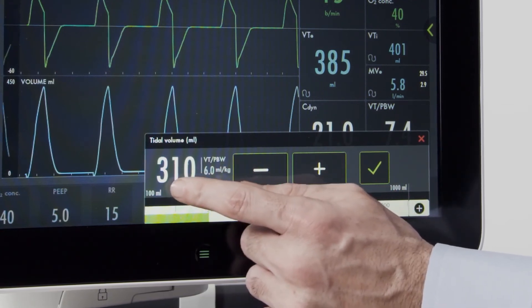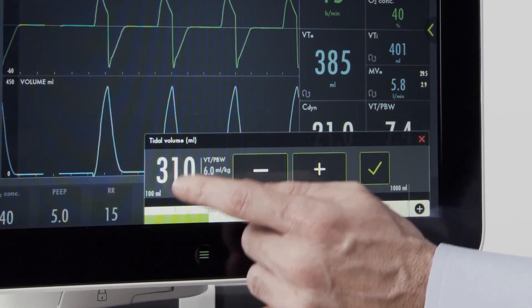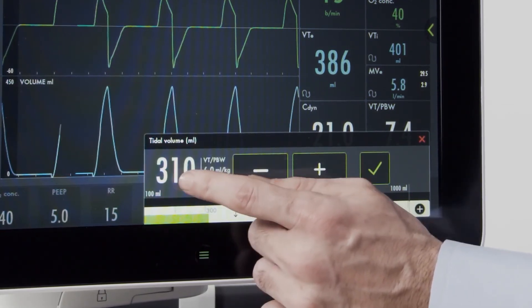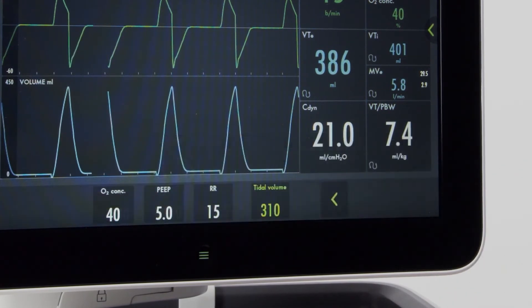If I drop that to 6, I'll see that the proper tidal volume for this patient is 310 mL to deliver 6 mL per kilogram.